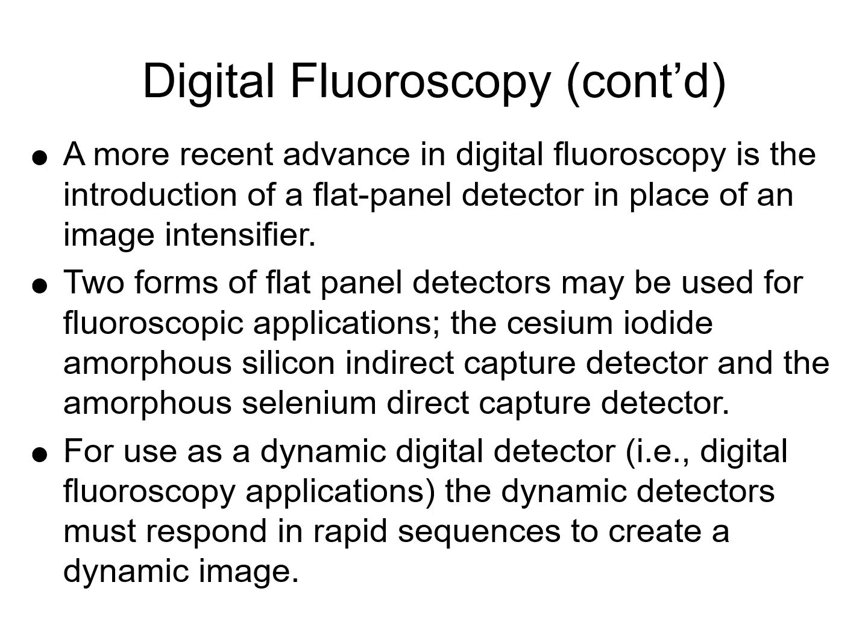The indirect detector relies on cesium iodide to create light, and so it relies on light, not X-ray, to store the pixel intensities. But the amorphous selenium detector directly captures the remnant X-ray beam. It doesn't convert it to light first. So those are the two big types. They work in fluoroscopy just as well as they work in X-ray, and they're basically the same image receptor technologies.